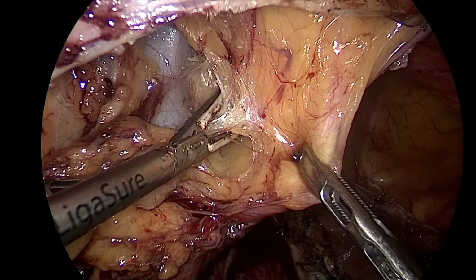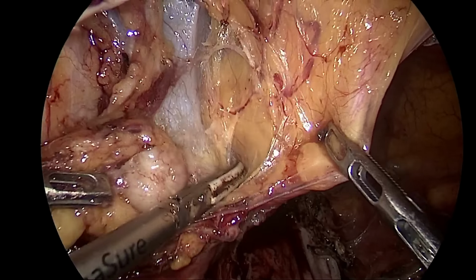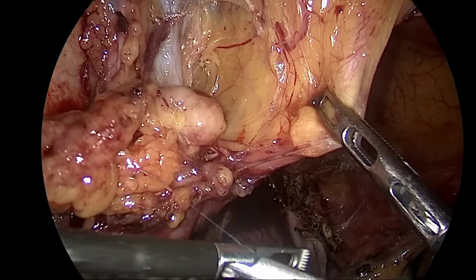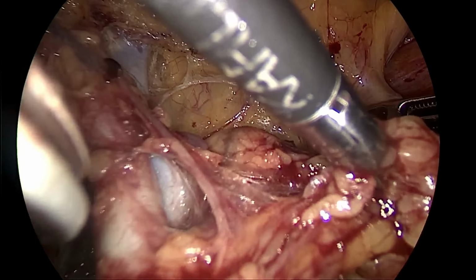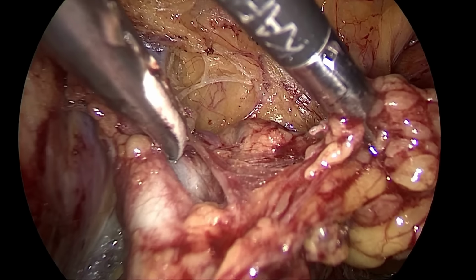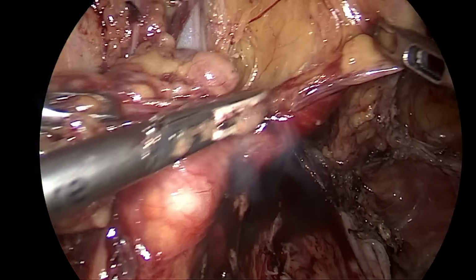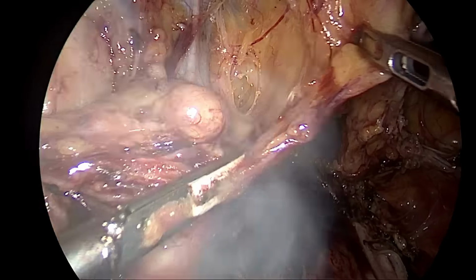Now we are separating the nodal channels with the lymph node from both medial and the lateral. The medial boundary is the obliterated umbilical. So there are some stuck nodes along with the external iliac vessels on the left hand side.